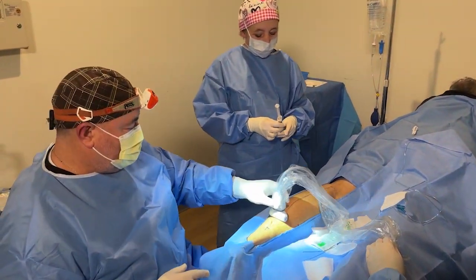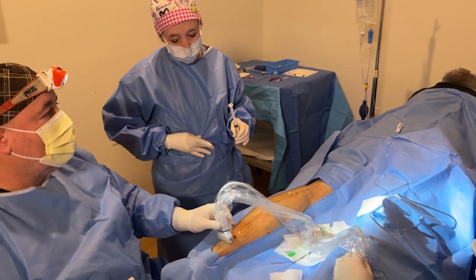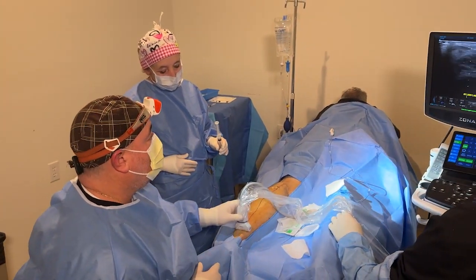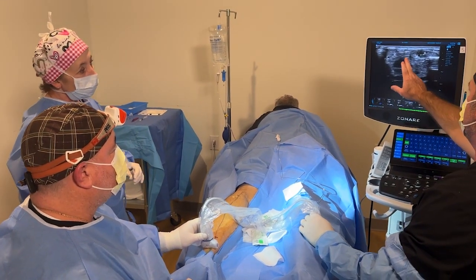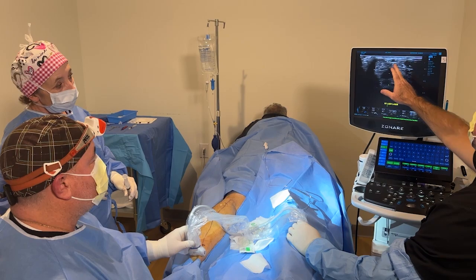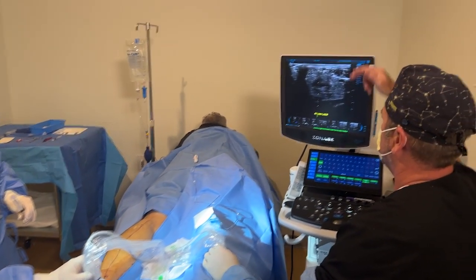The ultrasound machine shows us what we're looking at. What we're looking for is the vein. The small saphenous vein is winking at you where Scott's pointing. The skin is at the very top, and the muscle is all underneath.